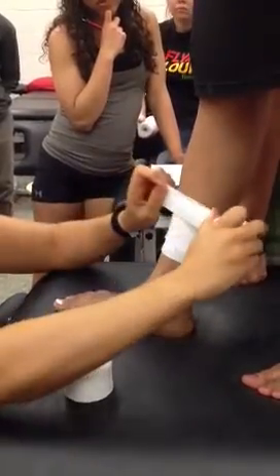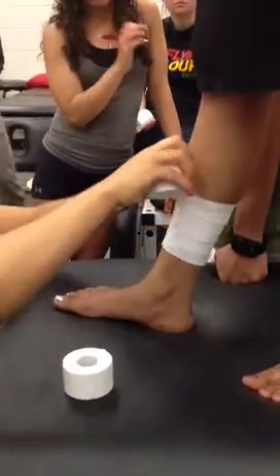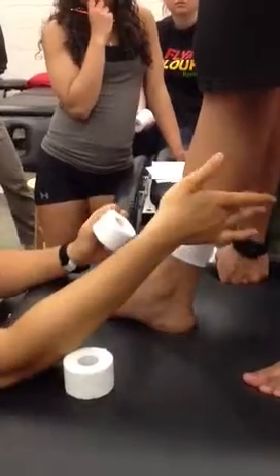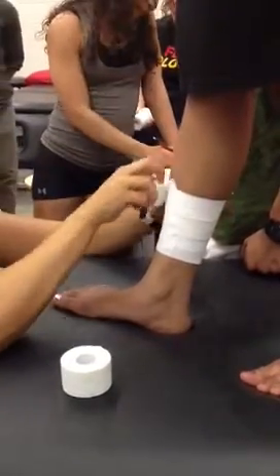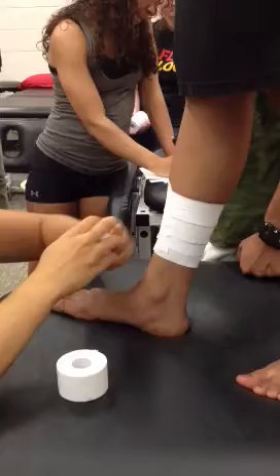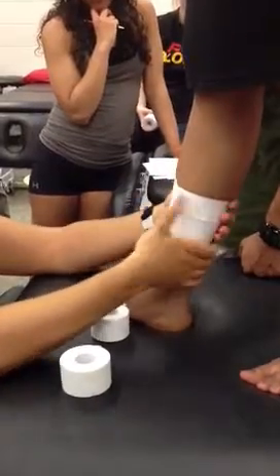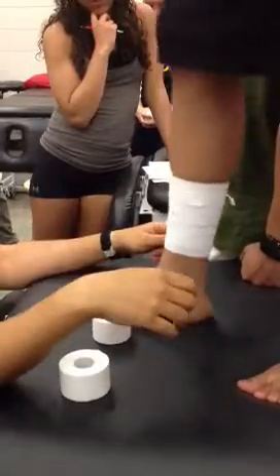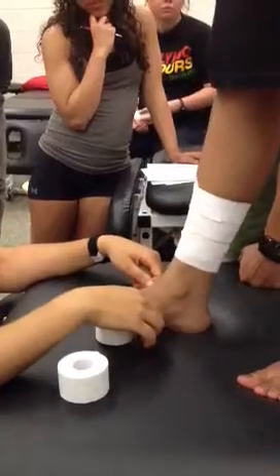Again, we're not going to cut into the muscle belly. Remember how we found the musculotendinous junction last class? You shouldn't go into the musculotendinous junction. Overlapping by half — seal, and then pull up. Now I'm in the last cast, so I'm going to seal. Do the seals matter in terms of direction? No, I'm just laying — I'm not pulling. They shouldn't be too tight either; it's just to avoid the tape from coming off, especially when they pull their socks on and off. Sometimes it starts to flail up. And that's tib ant.